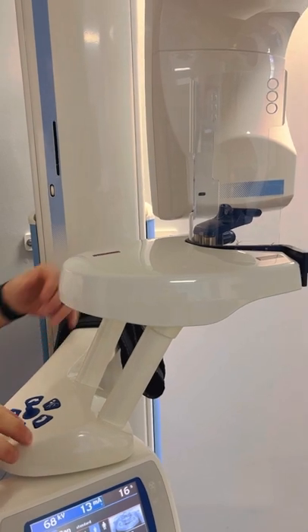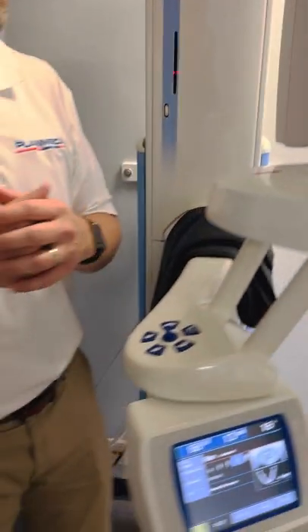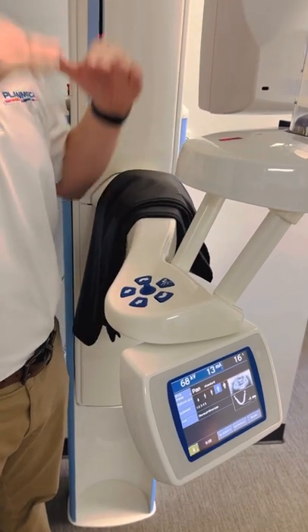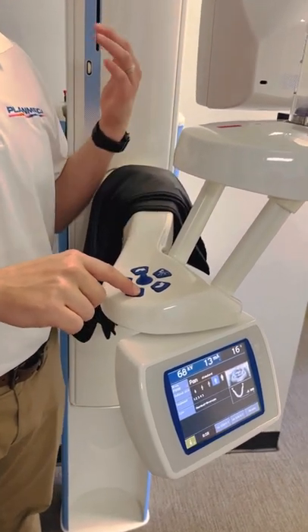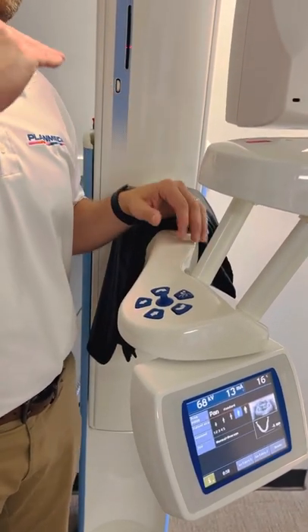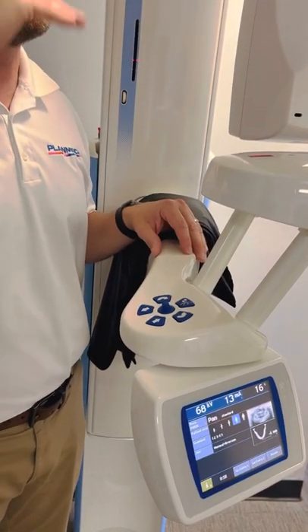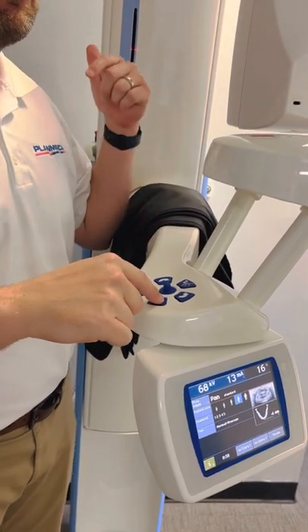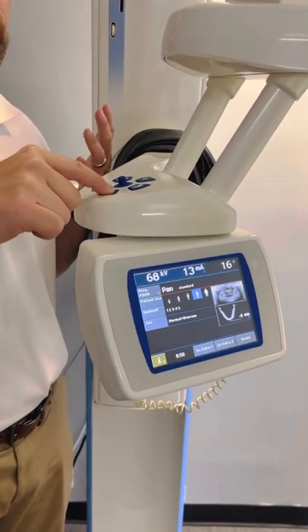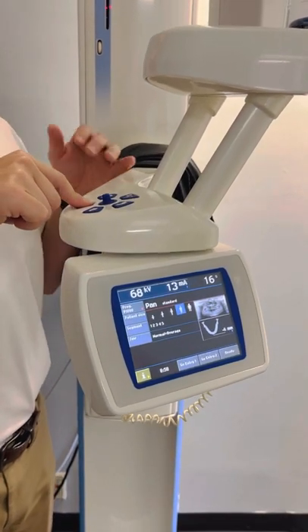The up and down arrow keys raise or lower the height of the machine, so you can accommodate a tall or shorter patient. It has three speeds — go slowly at first, especially if they're on a bite stick. If you hold the key longer, it kicks into medium then high speed. When you let go, it goes back to slow speed. Adjust this to the proper height for the patient.